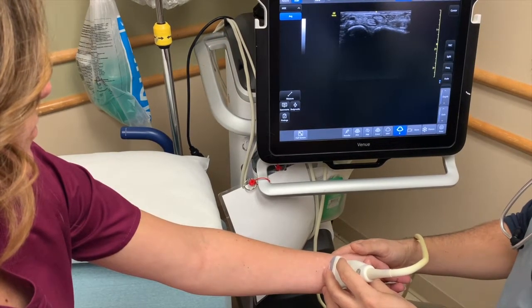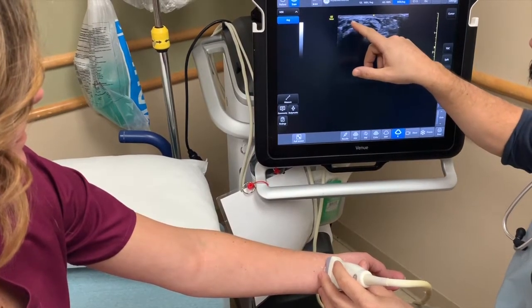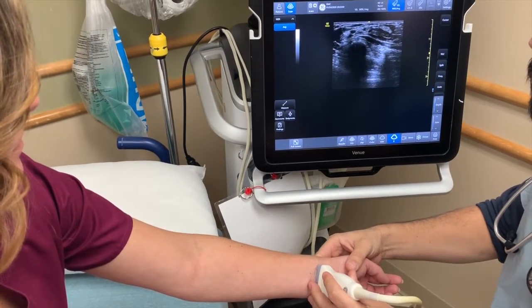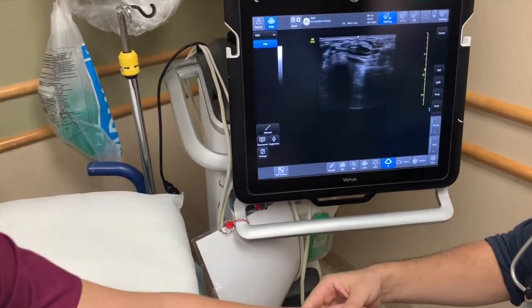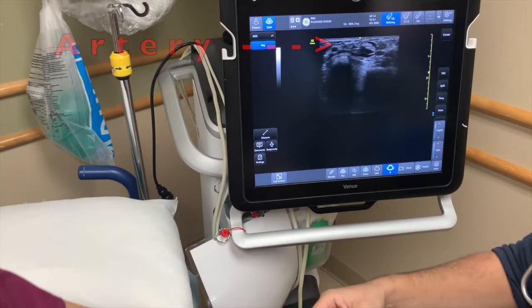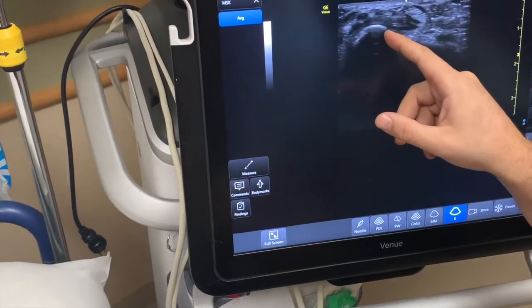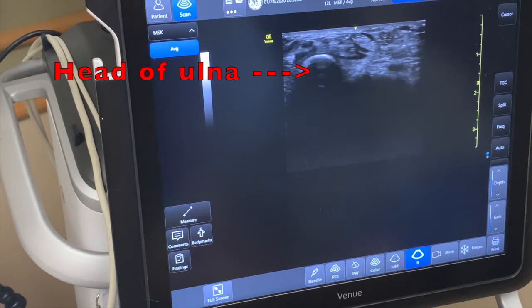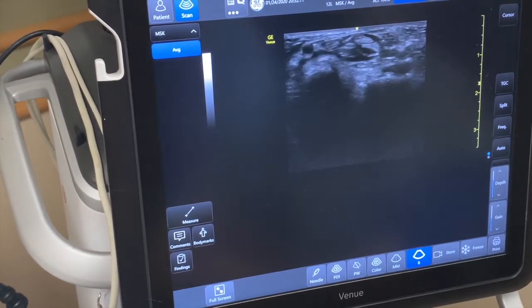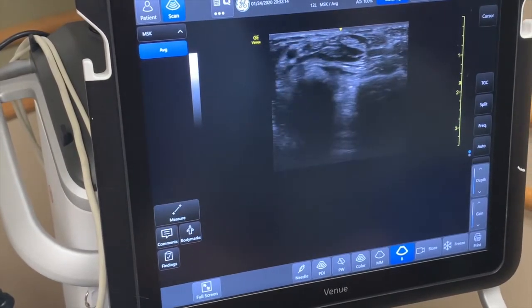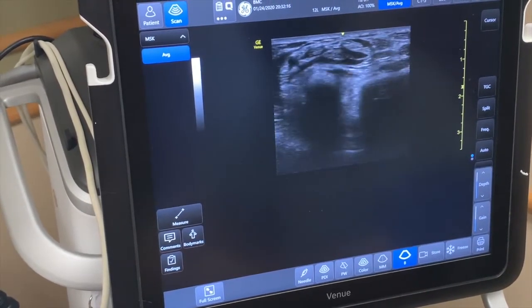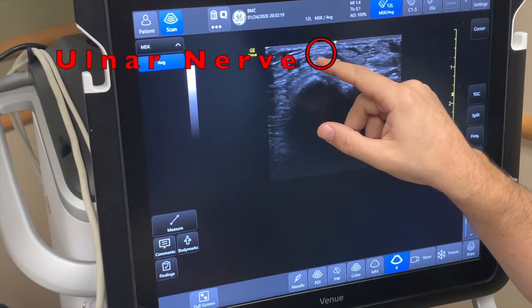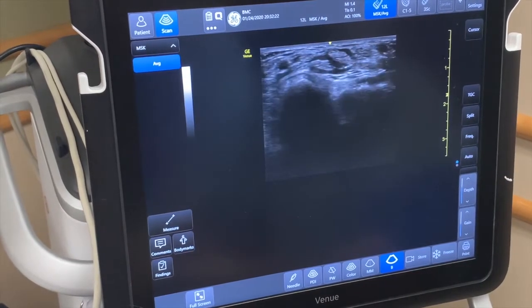The ulnar artery is probably the first thing you can identify over here on the ulnar side. You can see it pulsating with the pulse. This here is going to be the head of the ulna — you can see the bright white line there. The ulnar nerve can be identified right here, kind of going with the artery.